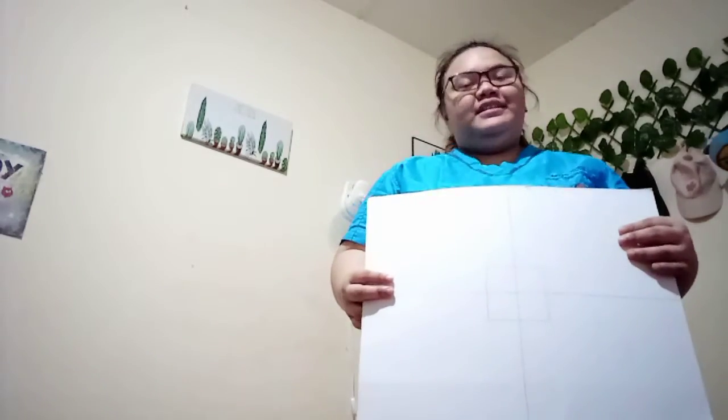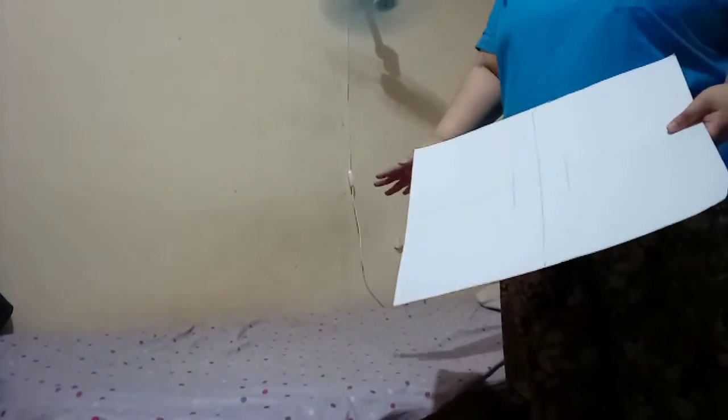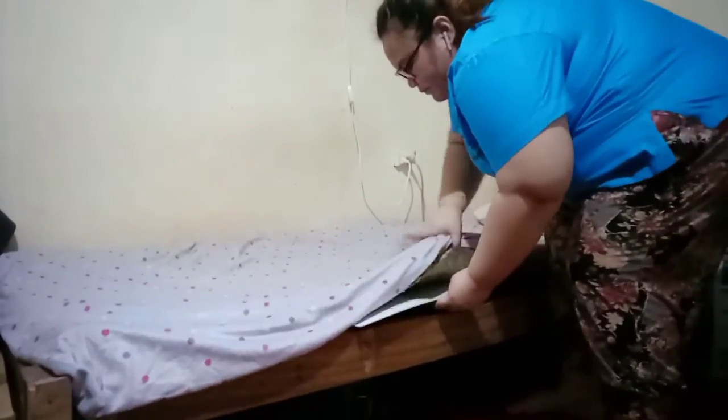Good morning. My name is Nikki Reyes, and today we will be having a return demonstration of AP projection of the femur as well as lateral projection of the femur. Right now, for the AP projection, we will be using 14 by 17 for the cassette, and for the SID, we will be using standard, in which it will be 40 inches. So now we will be placing the cassette below the x-ray table, assuming that this is an x-ray table. I will now place it to the center.